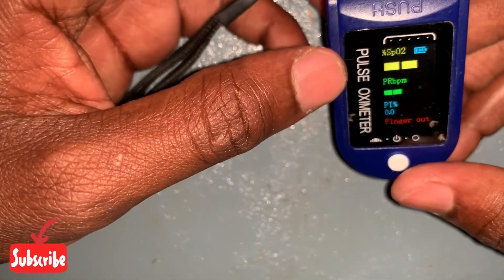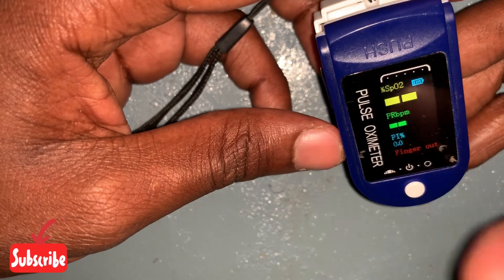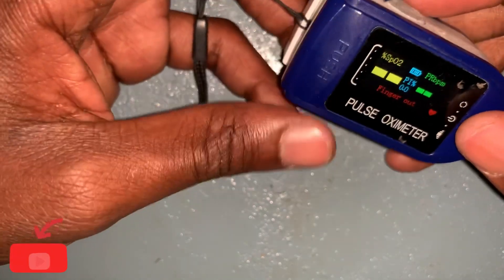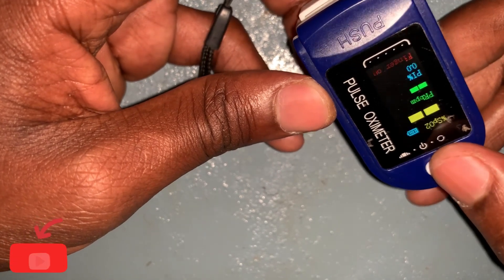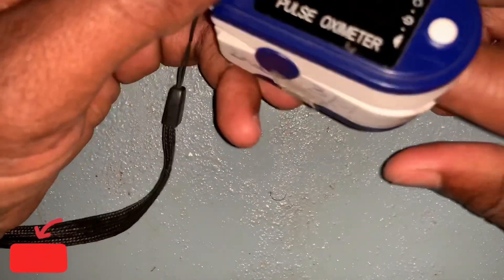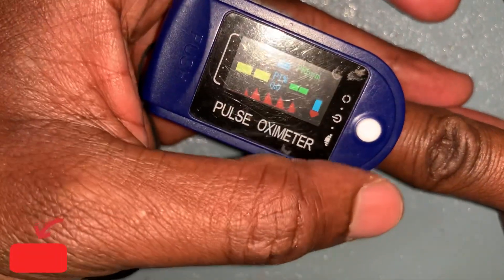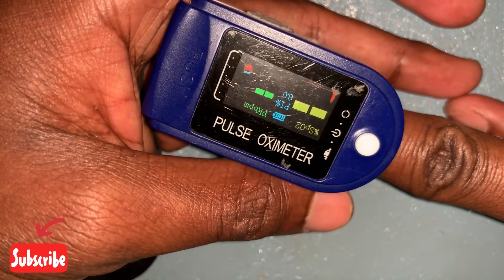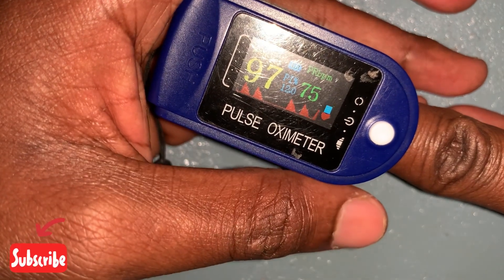You can also see that if you want to rotate the screen to landscape, you press the button. If you want portrait, you press it again. As you can see, it is displaying that my finger is out — indicating 'finger out.' Once I put my finger in and turn it on, it will show the reading. I can switch between portrait and landscape depending on the location and orientation I need.